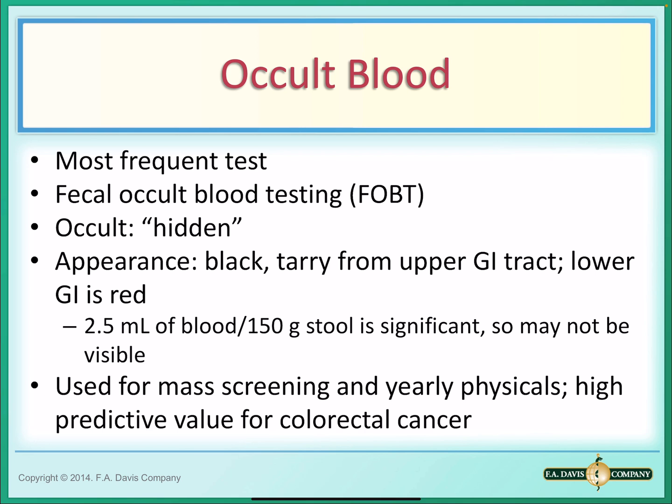So there are different methods. The common method for detecting occult blood is the guaiac method, but there are also immunochemical or fluorometric porphyrin quantification tests. The immunochemical tests and fecal porphyrin quantification tests are more sensitive and more specific than the guaiac-based fecal occult test.